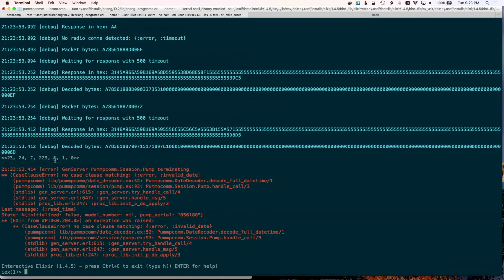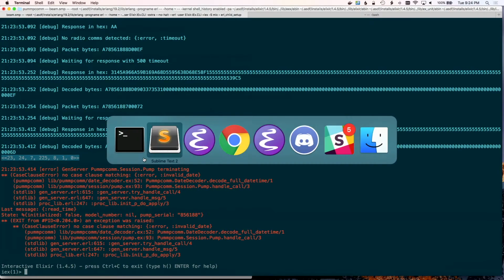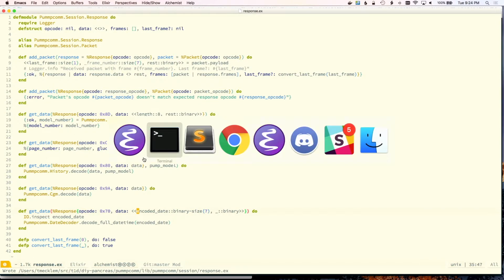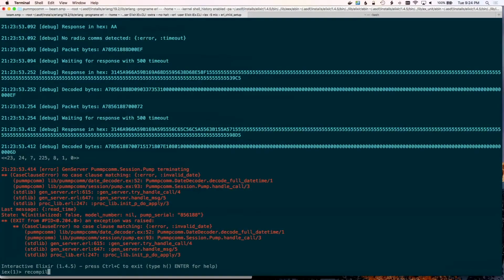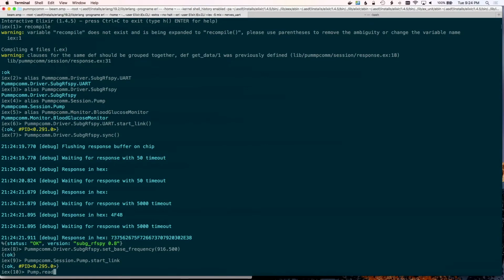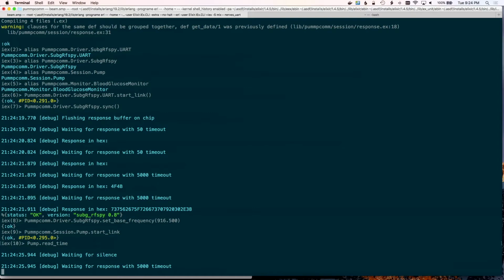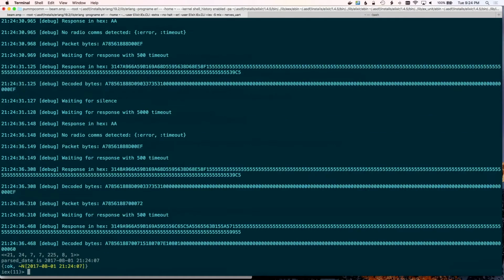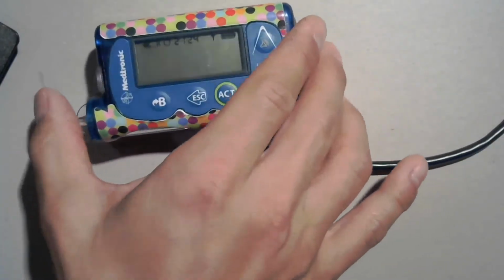So good things. 1, 2, 3, 4, 5, 6, 7. Now I'm off by 1 again. Sure. All right, I got my date back. Finally. So when I call read time, I get 2017, August 1st at 9:24:07. This is an Eastern Daylight. So, yep, you can kind of see here. That's my date.